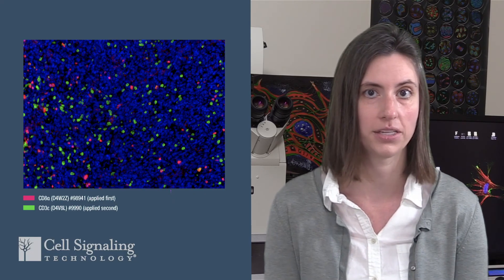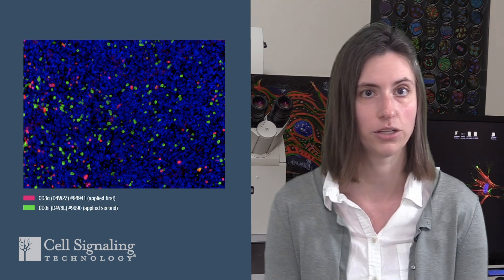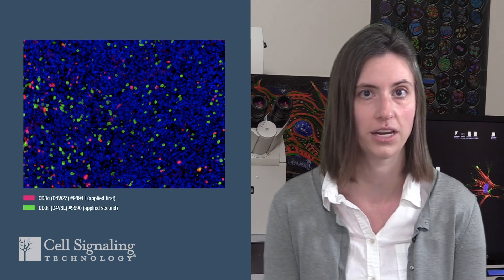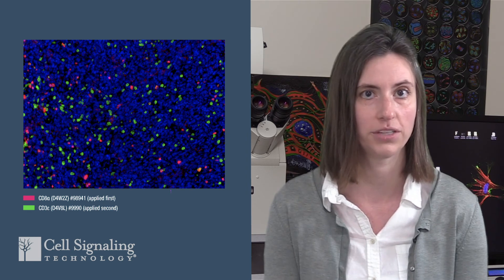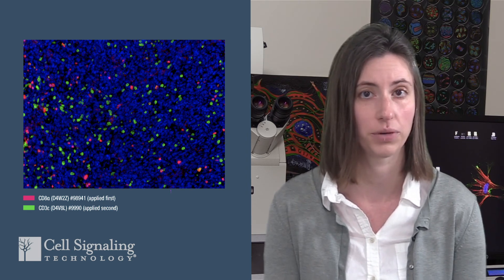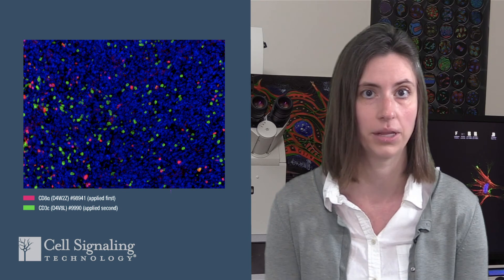Now that we understand epitope degradation, let's define epitope masking. This can happen in MIHC when two or more of your antibodies detect targets expressed in the same subcellular compartments of the same cell types. Tyramide deposition from the first antibody can blanket nearby epitopes, reducing the signal of subsequent antibodies in your panel. In this MIHC analysis of a metastatic tumor in mouse lung, CD8 staining in red is largely exclusive of CD3 staining in green. Because we would not expect a majority of CD8 positive T cells to be CD3 negative, this suggests epitope masking is taking place.